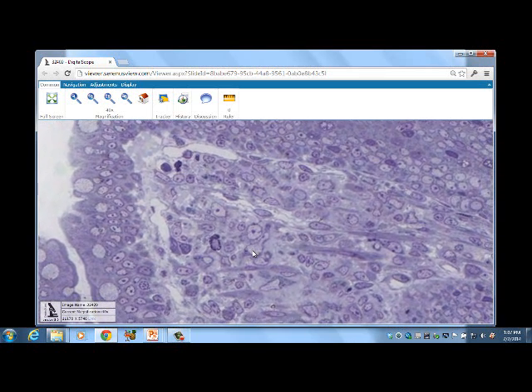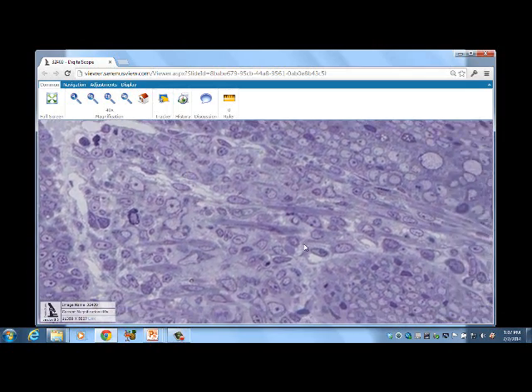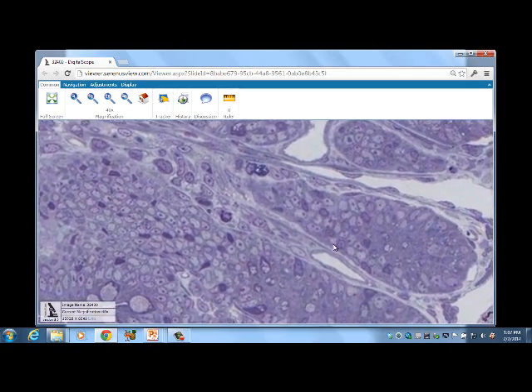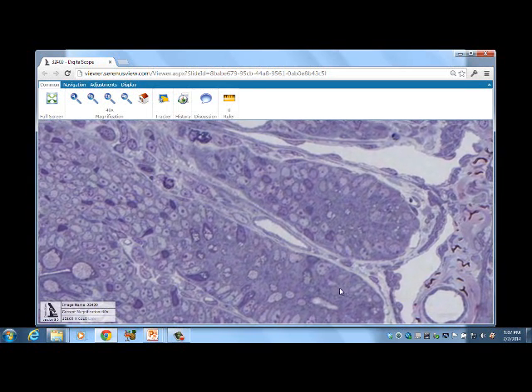But inside here, you should be able to see some macrophages with different sizes of products that are taken in. And you see these long line cells here. These are smooth muscle cells in the lamina propria. Lamina propria is a connective tissue between the intestinal absorptive cells.